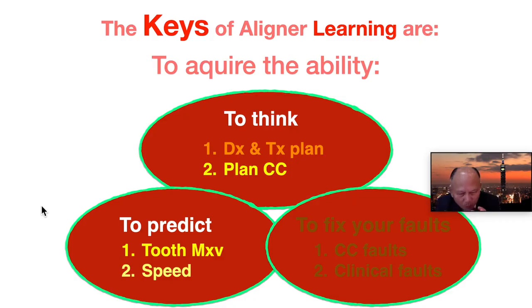After you have the right diagnosis and treatment plan, now we get into stage 2, the next level. How do you plan the ClinCheck? When you plan the ClinCheck, you really need to have a clear vision to predict the tooth movement and the speed of that tooth movement. Without that ability, it is hard to come up with a reasonable treatment ClinCheck.